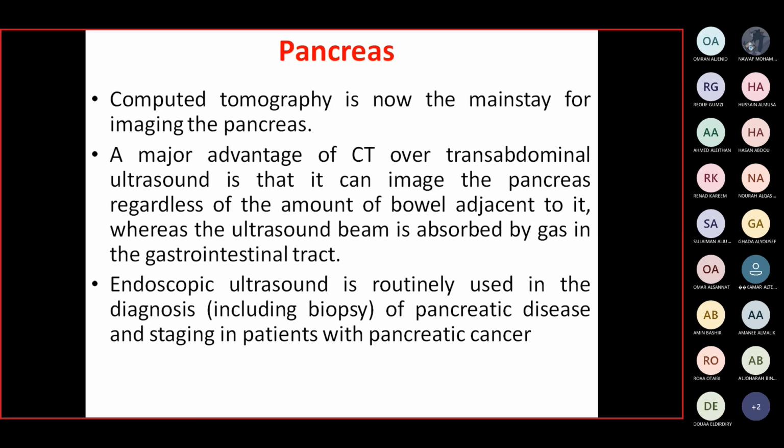Also, endoscopic ultrasound is routinely used in diagnosis of the pancreas. One of the advantages of endoscopic ultrasound is that it can include biopsy. You can take a biopsy with this endoscopic ultrasound. We can take a biopsy from the lesion in the pancreas when we use this technique.